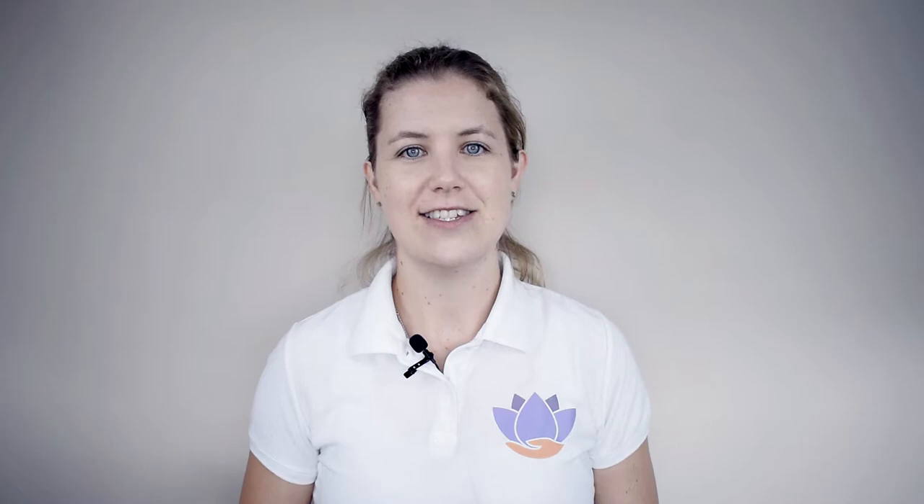The Essential Wellness Foldable Walking Stick is adjustable, portable and lightweight. You'll be able to use the folding walking stick when you're standing for long periods of time, or if you're out and about and get caught short.